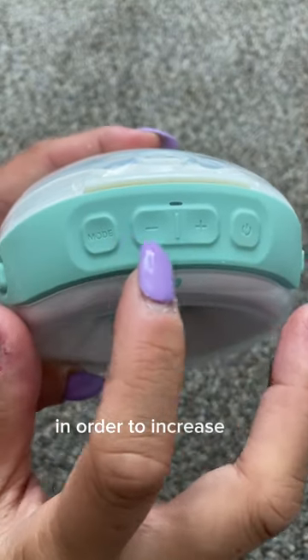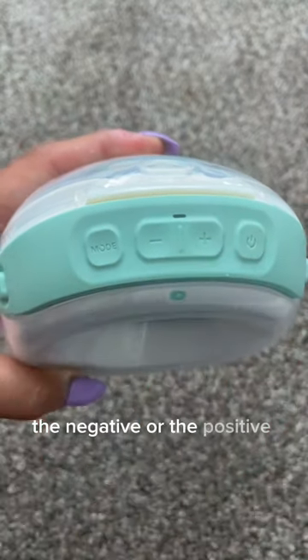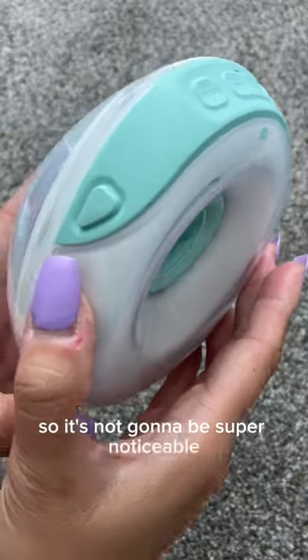In order to increase or decrease the level of suction in either mode, you would just push the negative or the positive sign. As you can hear, while it's working, it's relatively quiet, so it's not going to be super noticeable when you're pumping.